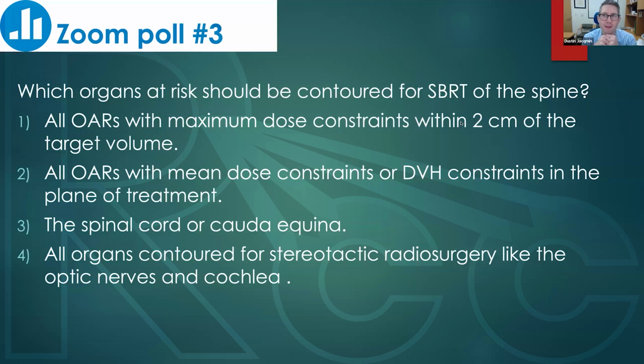Oof. If you chose to do spine SBRT without a 6 degree of freedom couch, you would really need a plan for what to do if you could not align the spinal column accurately. That could look like repositioning the patient over and over until things look pretty much perfect. Or that could look like just using a larger margin around the spinal cord in order to increase the sparing and increase the margin for safety. It's something you'd really want to think hard about.